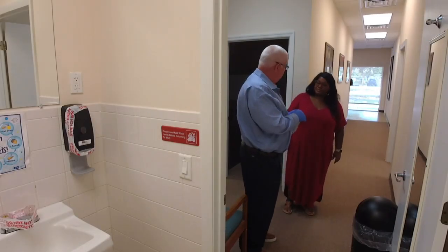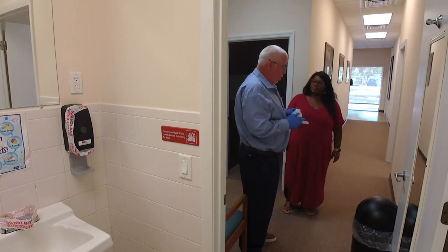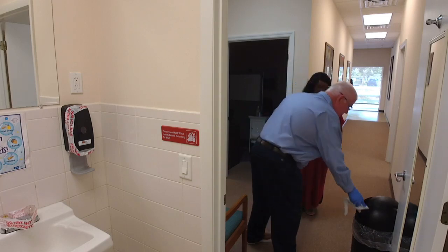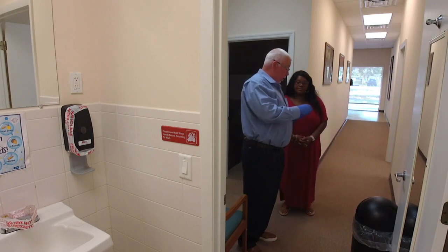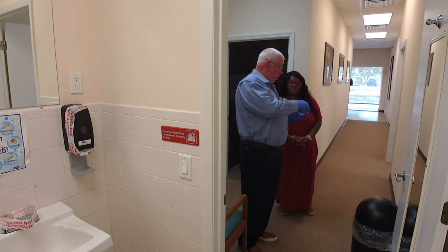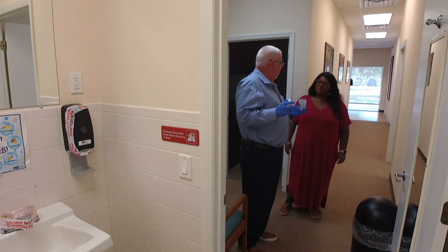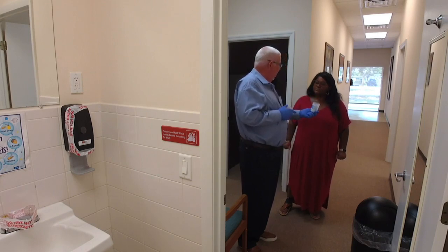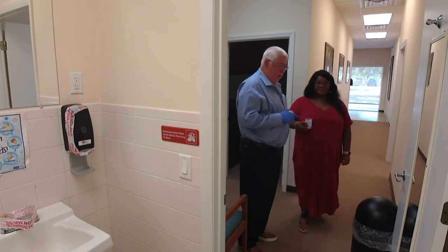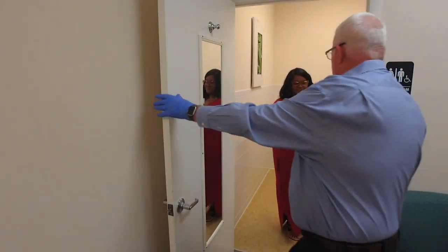Okay, Char — here's the collection cup. You're going to be going into a secure restroom; the water sources are secure, there's nothing in there that you can use to tamper with the product. I need you to give me a specimen up to this fill line right here — a little more is fine. Just bring it out; I'll put the lid on it when it comes out. Don't wash your hands — you can do that afterwards. If for any reason you can't go, come on out. Go ahead and use it up to the fill line. The restroom is secure, so I'm going to go ahead and close the door for you.